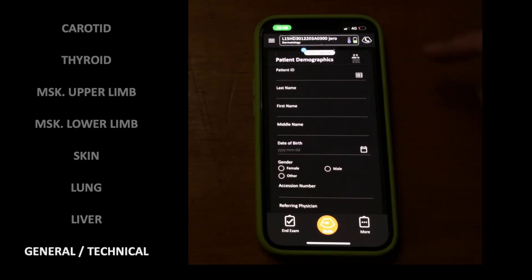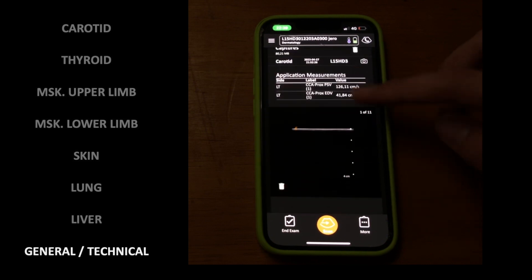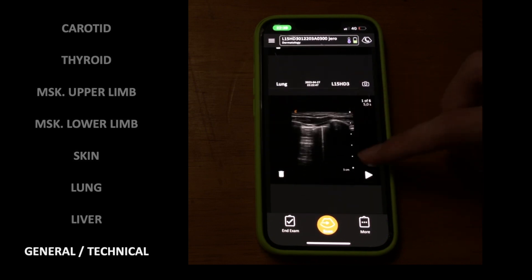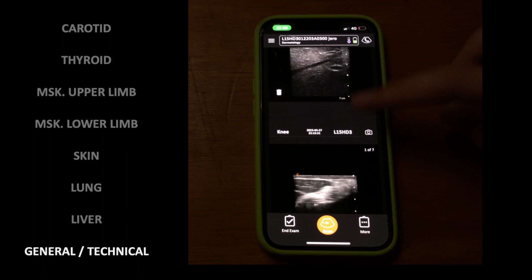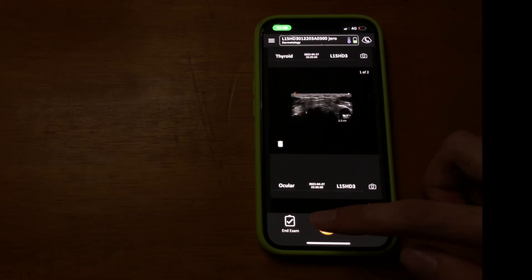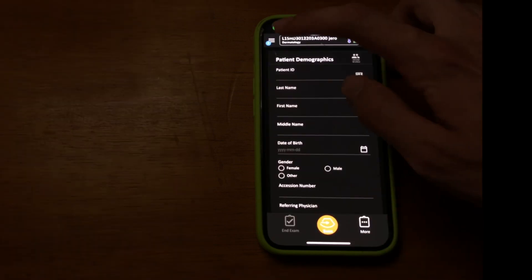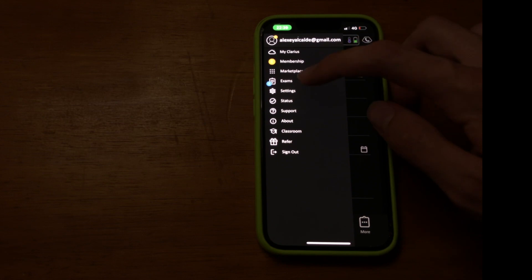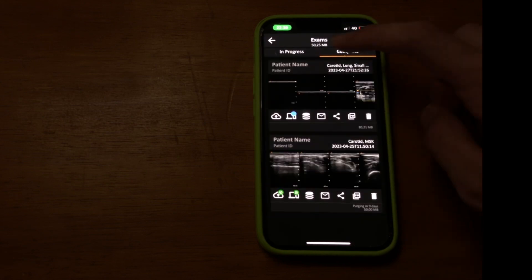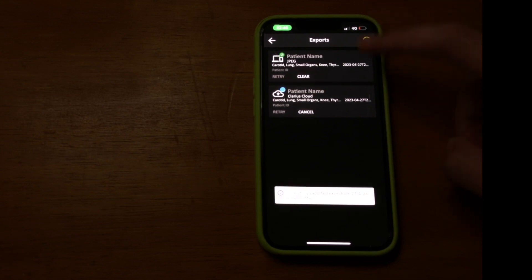Now I'm going to run through the exporting process. First, click on the upper left corner of the screen — these are all the clips recorded from the same exam; you can delete the undesired ones and so on. The end exam button at the lower left corner opens the exporting options menu. You can select: upload to the cloud, send to a reviewer, export via DICOM, JPG, and even create a PDF report. Here you can see the progress — and voila, very few seconds!